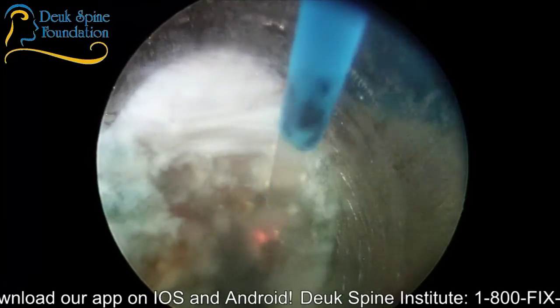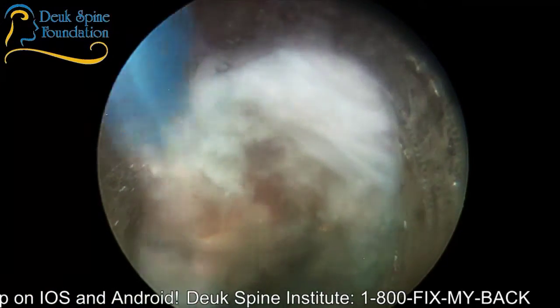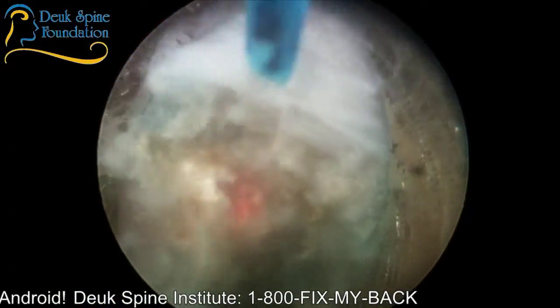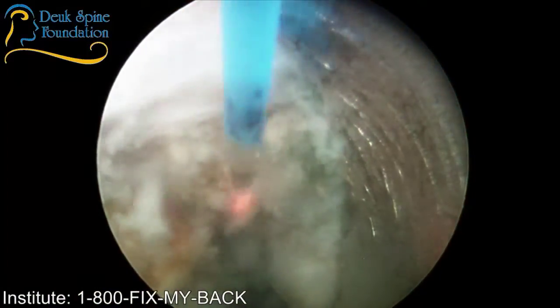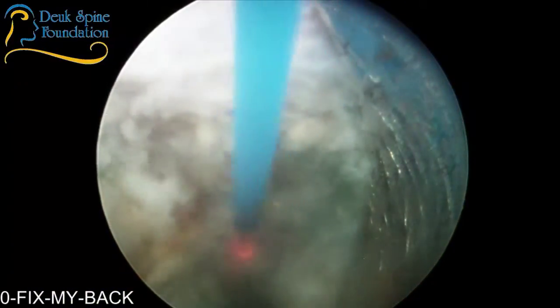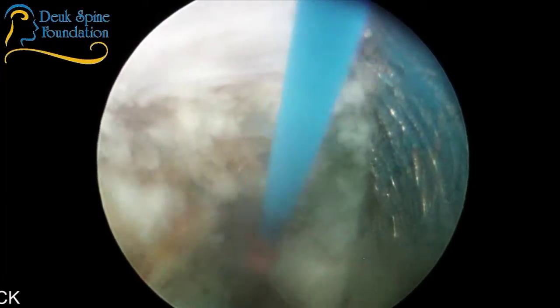All right, so we're just finishing up Deuk laser disc repair at L45. I apologize. Earlier I said that was the end plate of L3. It's actually the end plate of L4. And we're going to go to L34 next. So we're at the L45 disc. We've already completed L5S1.